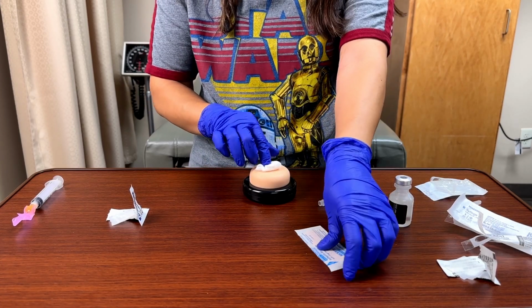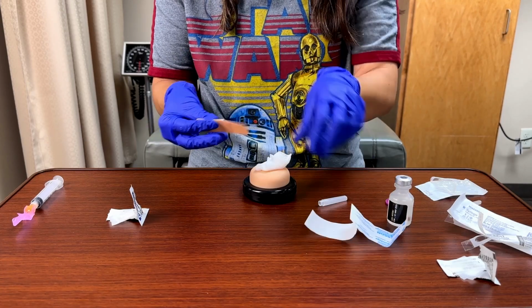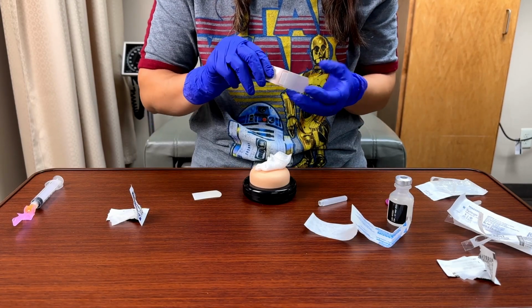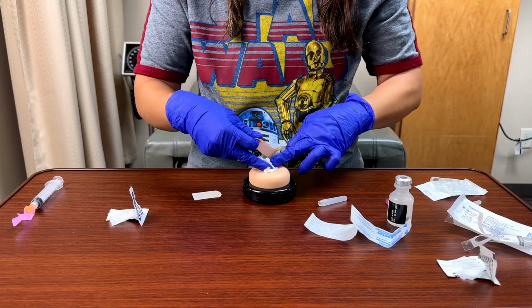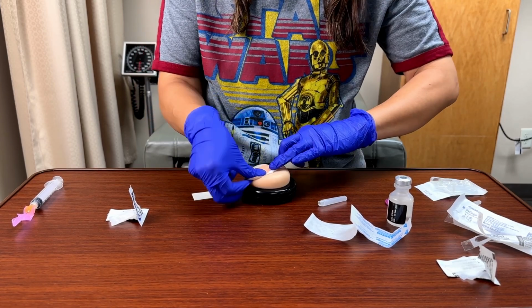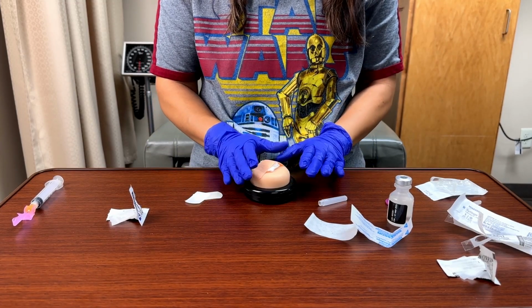So usually I'll have a cotton swab. I'll open this up. And I will place my bandage. So usually it'll be kind of a wadded up cotton. And then I'll place my bandage like so. And once I'm done with that, the procedure is actually done.